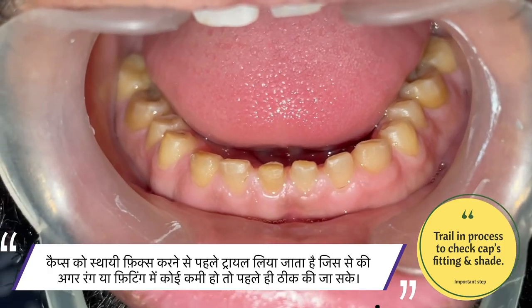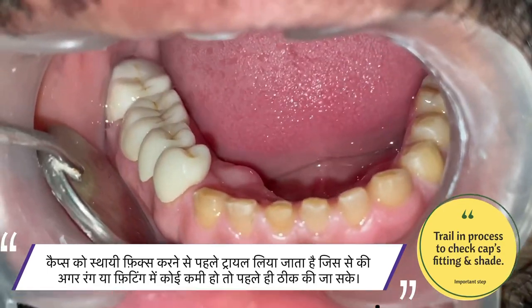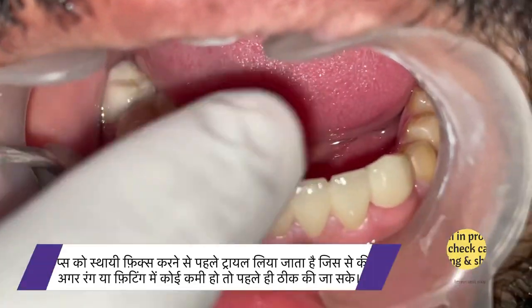Now we are going to test all the zirconia crowns once before fixing them, so that if there is any issue in color or fitting, it can be corrected before fixing them permanently.